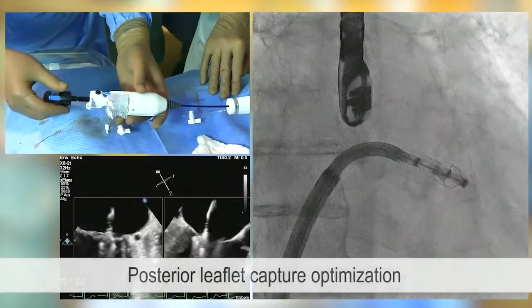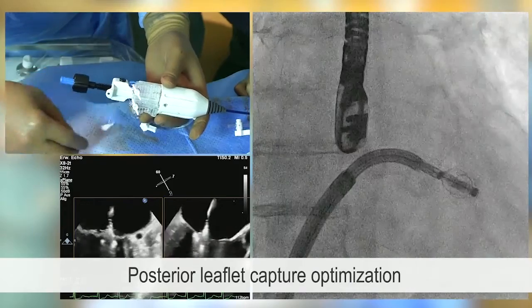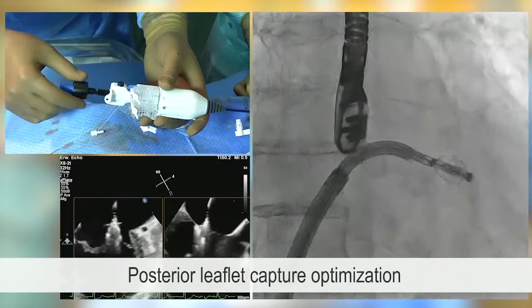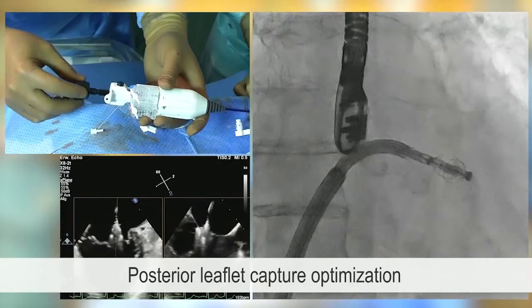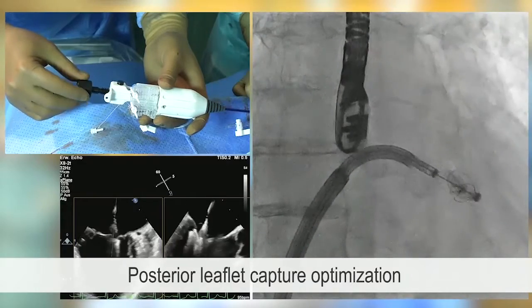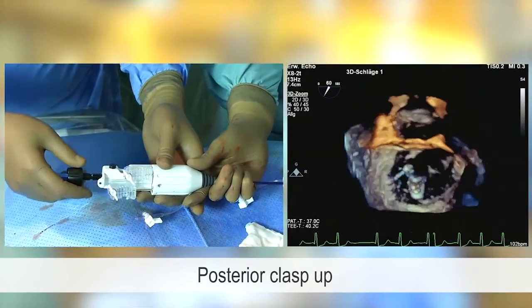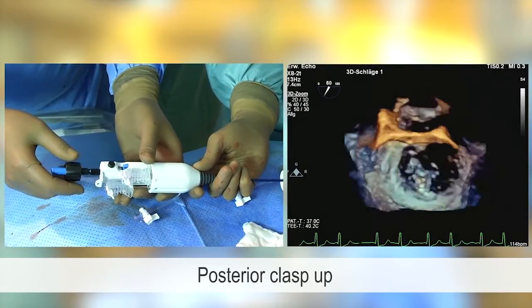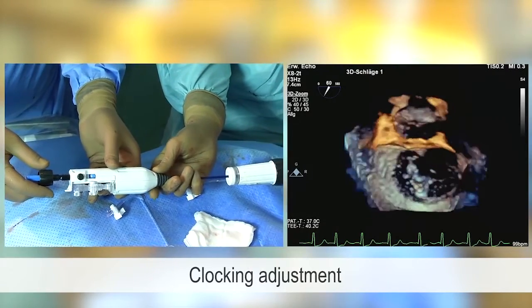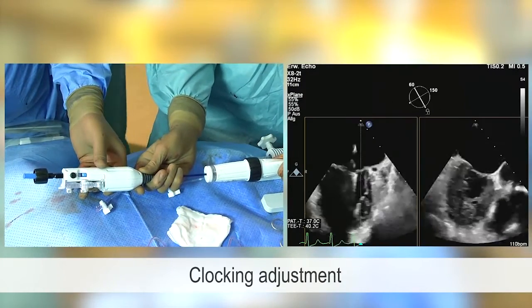So what we're doing now, we see that the posterior leaflet is still quite mobile, so we now do what is referred to as single leaflet optimization. We leave the anterior leaflet where it is, nicely in. We open the device and we bring up the posterior clasp, as you can see in a second, trying to get even more in of the posterior leaflet, and at the same time double checking the clocking. Here you can see that the clocking was not perfect, so this is corrected for now. The device is now turned clockwise to get a better clocking. These are little changes, but they can have major effects.